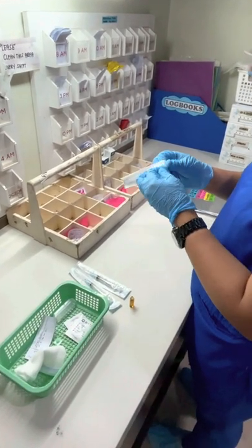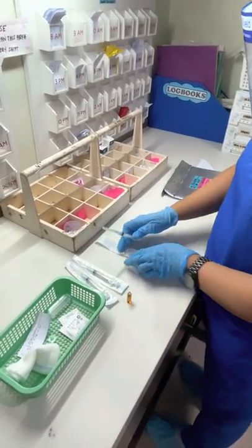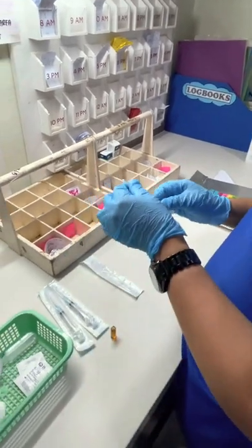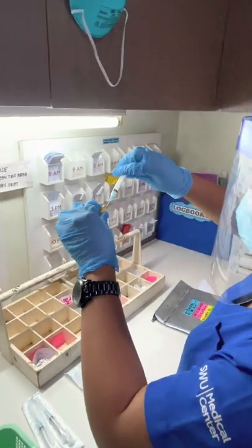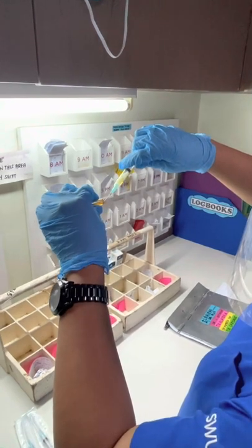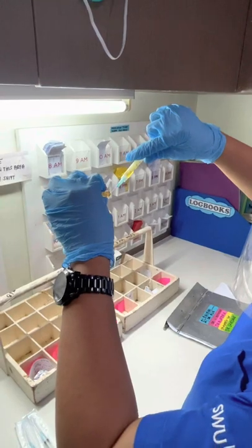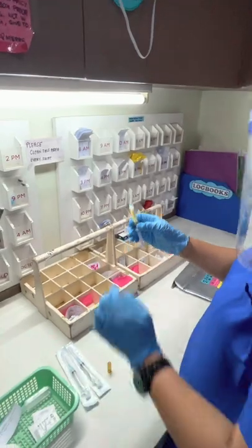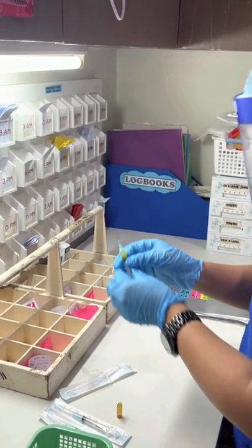As you can see, the technique of our staff nurse was well executed. Take the syringe out of its package and make sure you check the barrel, the plunger, and that the needle fits perfectly. Insert it directly into the ampoule — it should be at eye level when you withdraw the medication. Be very careful withdrawing the medication from the ampoule because it might spill. Gently flick the barrel and make sure you remove the air.